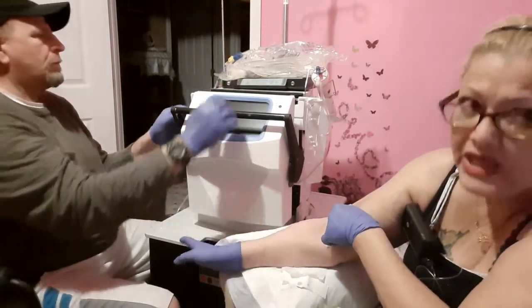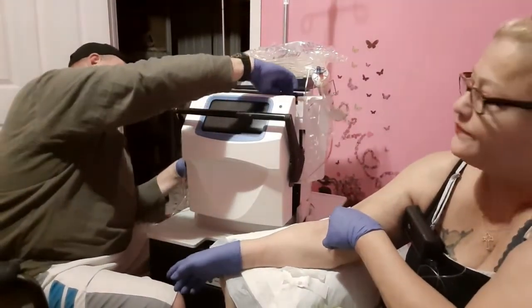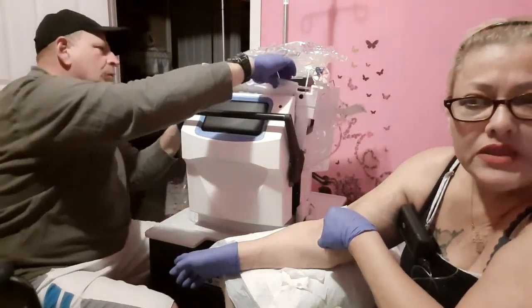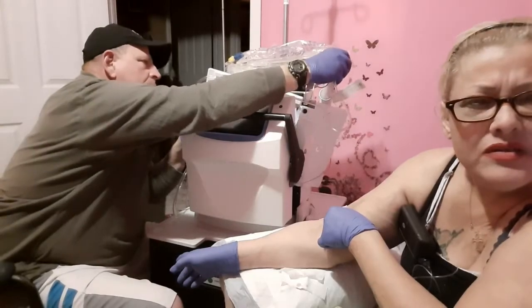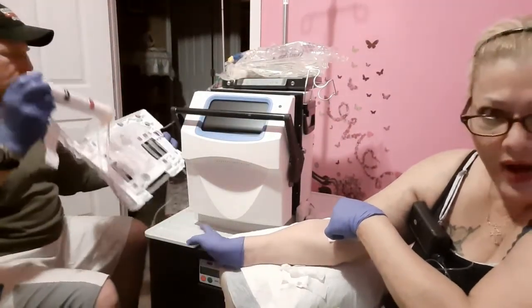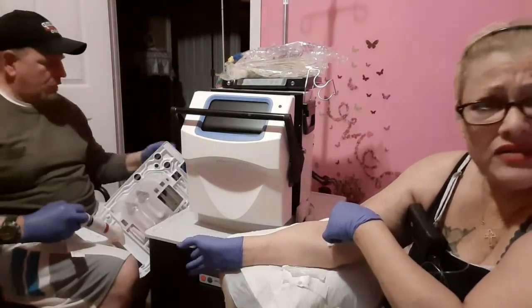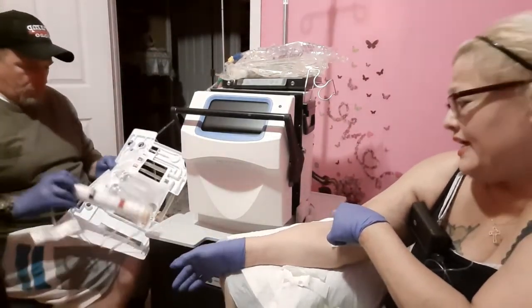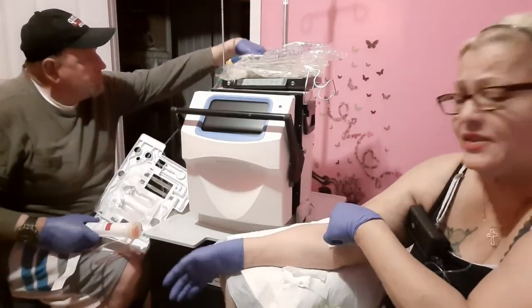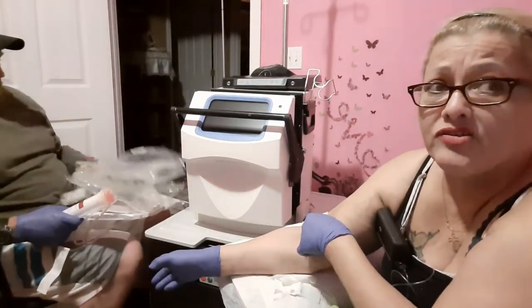We cleaned the bin with one part bleach to 10 parts water, and we wiped it down. Then we sanitized it with some of that sanitizing solution. And we're going to put the fan on it and leave it on there possibly all night. And in the morning, we'll go ahead and prepare a batch.